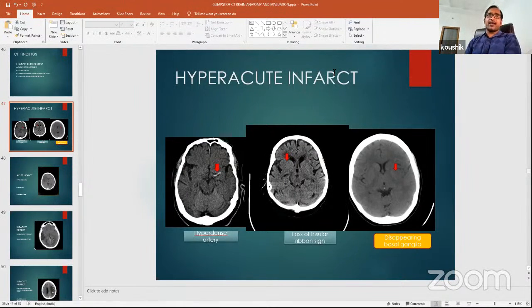In acute headaches, some of the patients, even young patients, show lobar hemorrhages where we find no reason. If a patient presents with a sudden onset of severe headache, a parenchymal hemorrhage is one of the possibilities. In chronic cases, whether you do an MRI or a CT, the diagnosis will be the same.